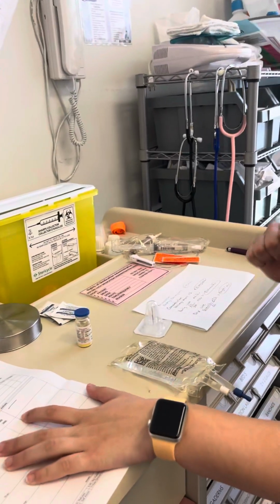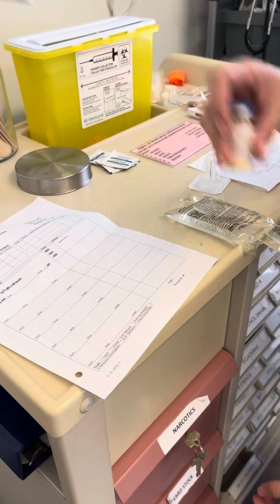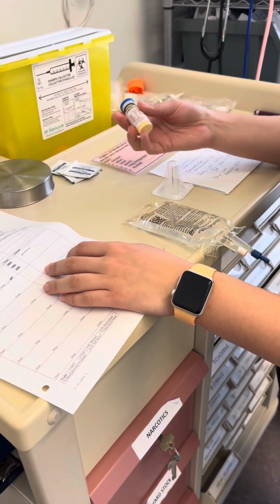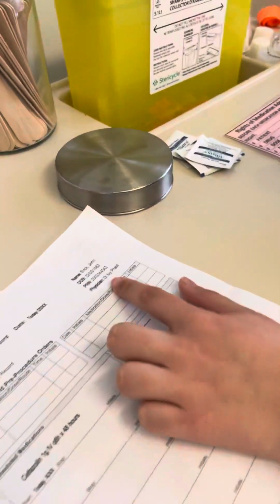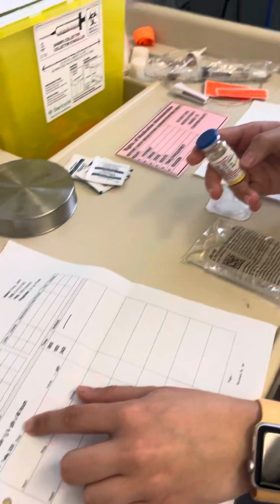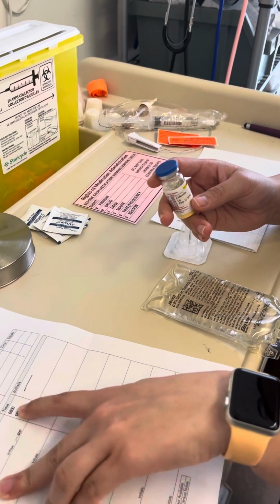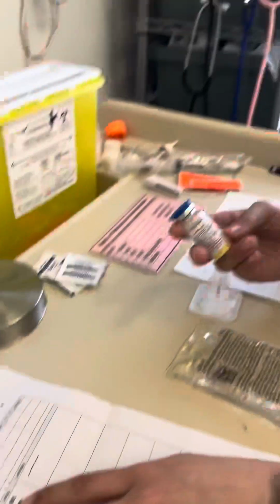So first we're going to refer to the MAR and the doctor's order. They match. Then we're going to do our first check after taking the medication out. Patient is generic, drug is cefazolin, dose is 1 gram, route IV. Time frequency is every 8 hours for 48 hours. It's 8 o'clock now, so we're okay to give it.